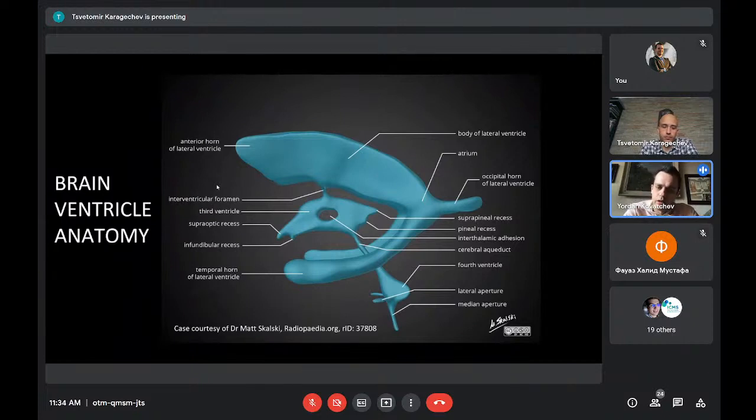there are two more slides that I want to show you, which are related to anatomy itself. So you know now what edema is, swelling of the brain, the two types of edema, and I'll show you a bit more how you can differentiate them on actual CT. But the reason that edema is so important to us is because it has mass effect.